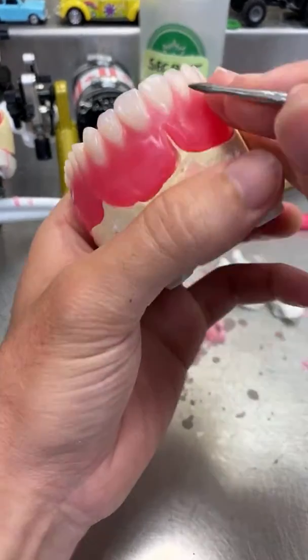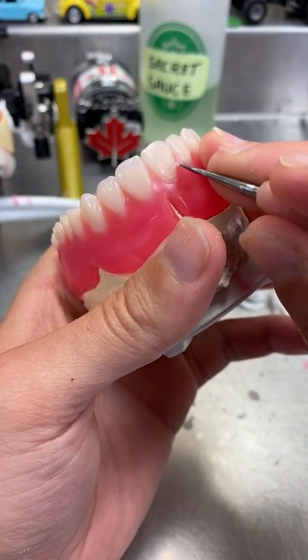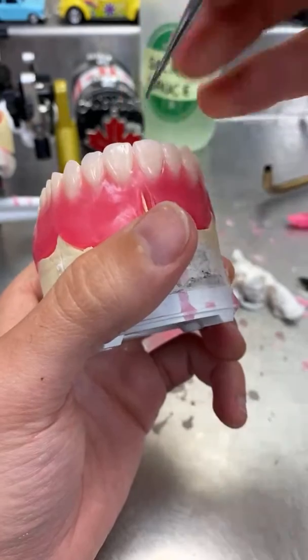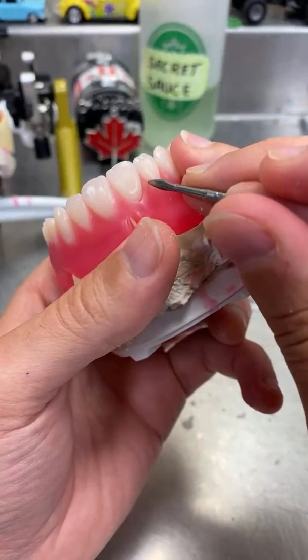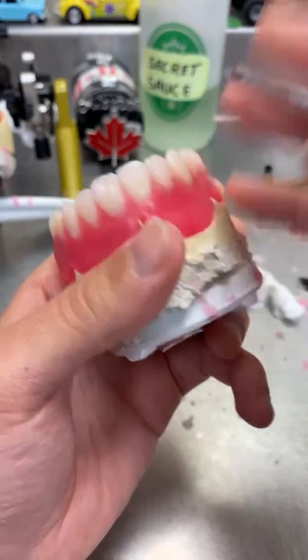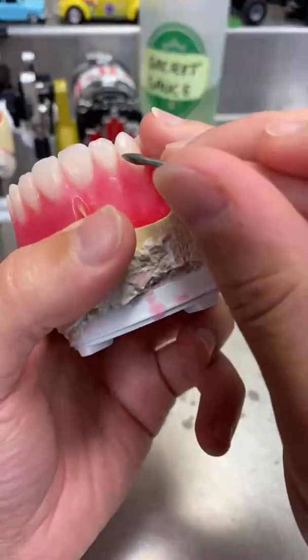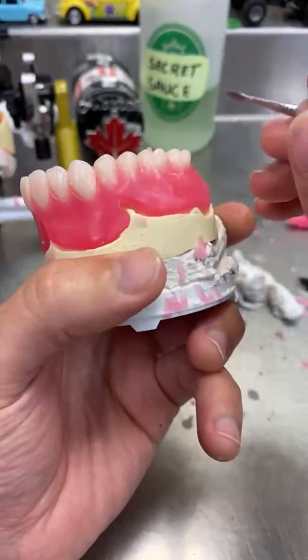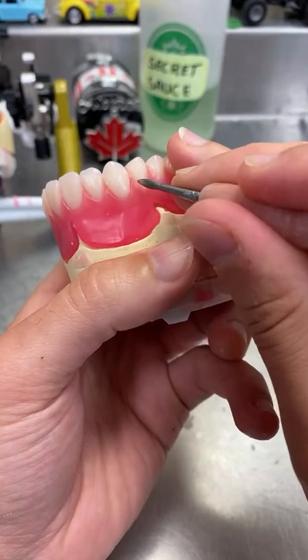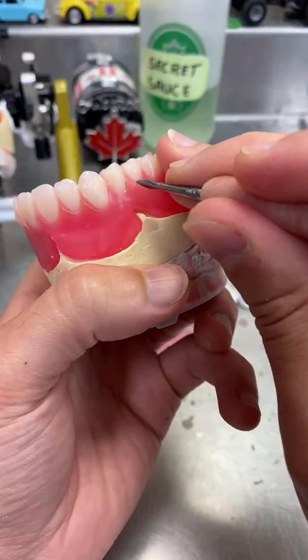Okay. It's important to work on the wax when it's cold for that step here, because you don't want it to stick everywhere. So the wax should be cold when you work on this case, so that it doesn't stick.